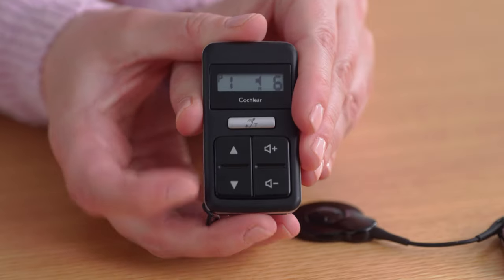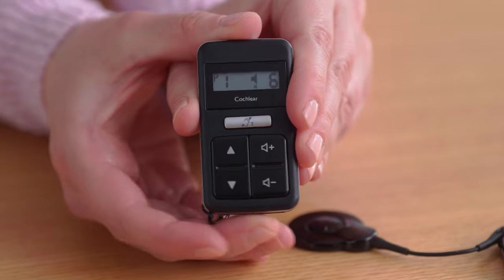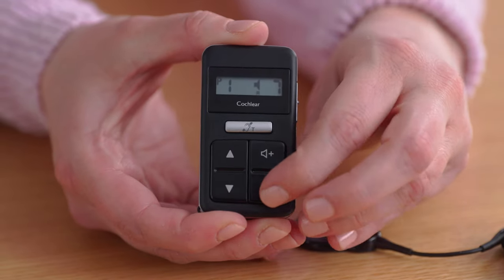Now that you've paired, you can control your processor. The arrows here are what change your programs, and the buttons here change your volume.